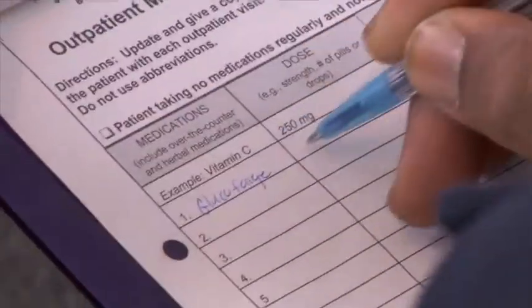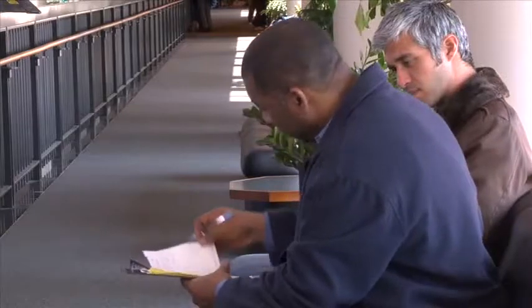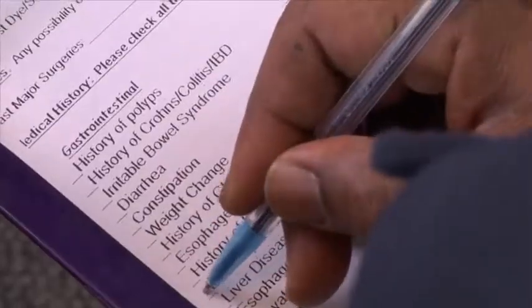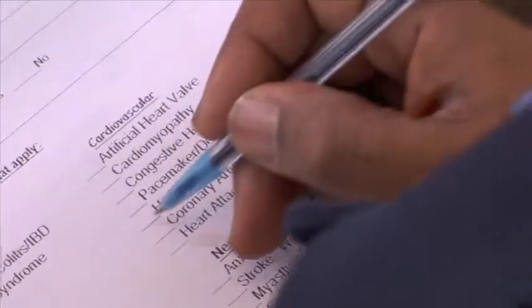Regardless of the reason an upper GI endoscopy has been recommended for you, there are important steps you can take to prepare for the procedure. First, be sure to provide a complete list of all the medicines you are taking, including over-the-counter medications and natural supplements. Also, inform your doctor about any allergies you have to drugs or other substances. Your medical team will also want to know if you have heart, lung, or other medical conditions that may need special attention before, during, or after upper GI endoscopy.